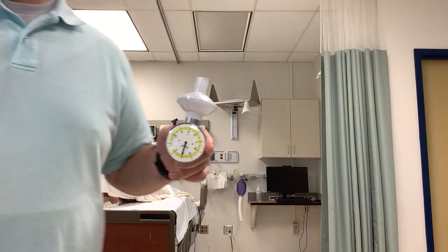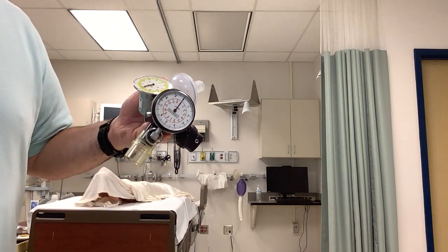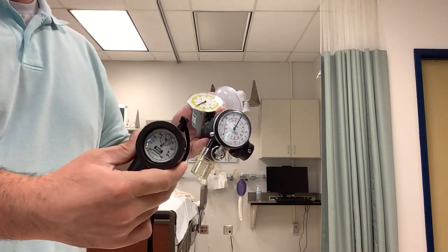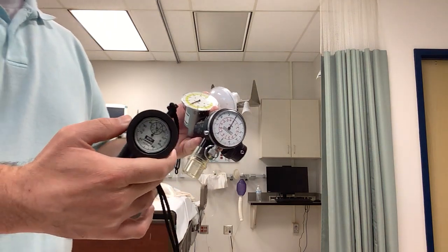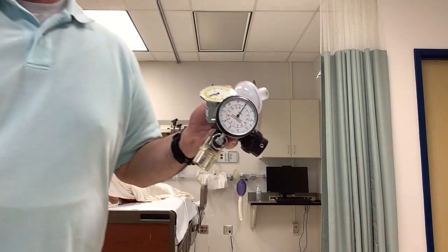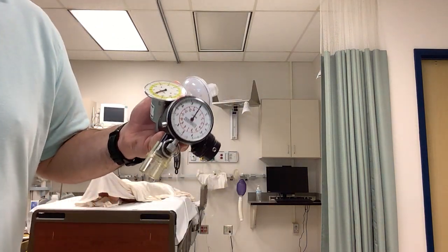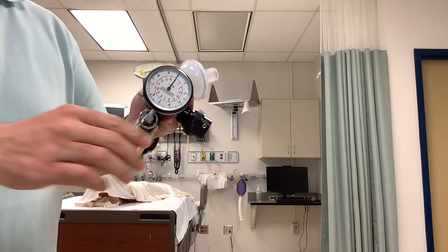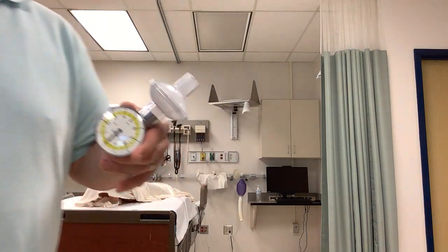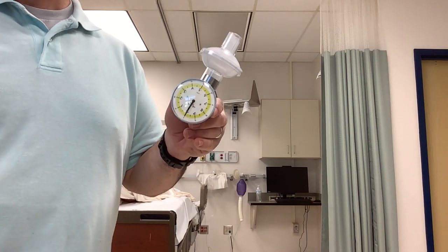You've got a multitude of different types of spirometers inside of the classroom that allow you the ability to measure exhaled volume coming from a patient. So really, they all work very similar in nature. I've got my mouthpiece attached to the Halo spirometer, so I'm going to utilize that one for the purposes of demonstration. But nonetheless, you can see that they are all pretty similar in nature, and I'll give you a closer shot of how they operate.